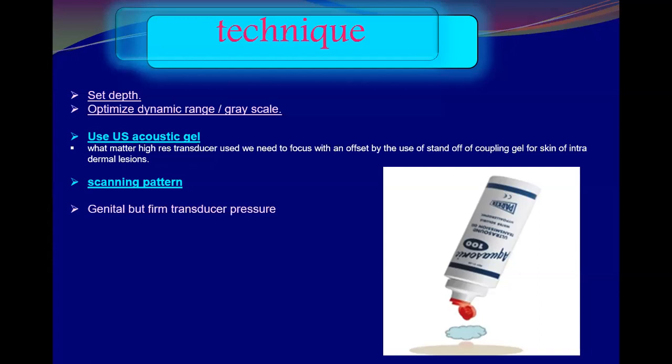Clockwise or radial. Okay, so we have one technique, radial and anti-radial. Excellent. This is one technique. There is another technique. The other one is circular.